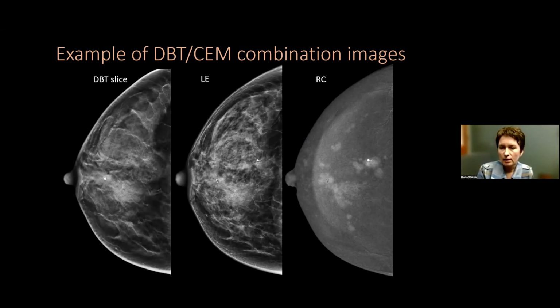And this is the image of a contrast distribution in the breast. And of course, you see immediately at a glance the extent of disease, all those multiple masses and non-mass enhancement, and how well it helps us delineate the extent of disease in this breast.